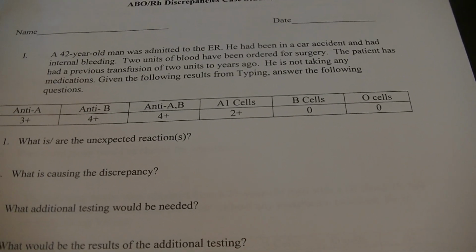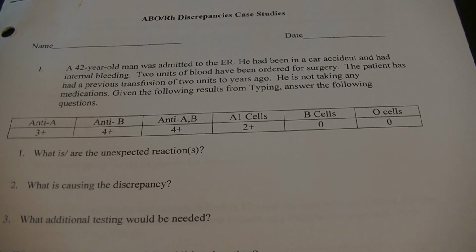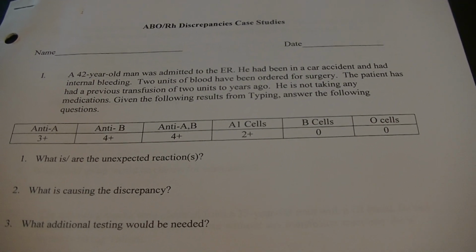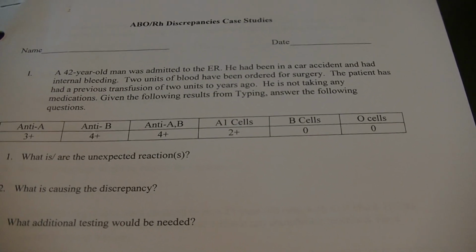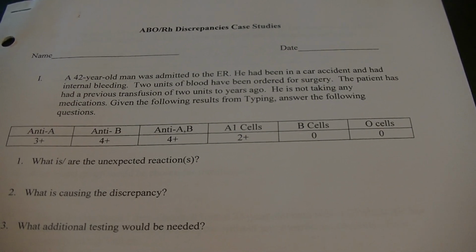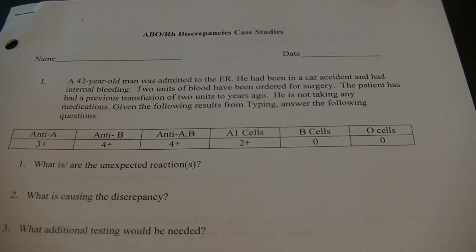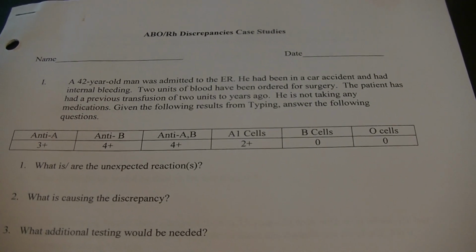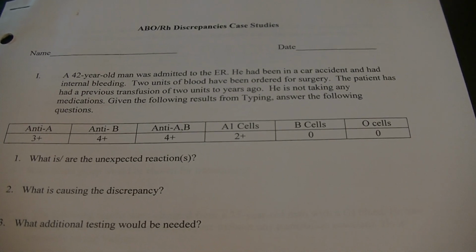So, what is the unexpected, or what are the unexpected reactions? Here we have strong reactions with anti-A and anti-B. So we can trust that this person is probably AB type blood. An anti-A,B is simply an anti-sera that also reacts with both the A antigen and the B antigen. And since we have a strong reaction there, it confirms that both A and B antigens are on the patient's blood cells. You do not always use an A,B anti-sera, but it can be used in the lab.